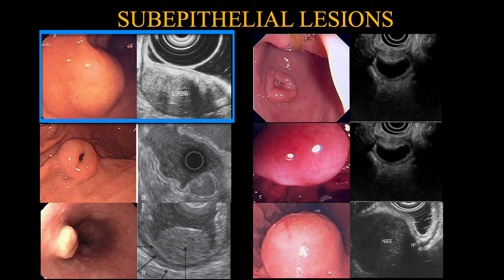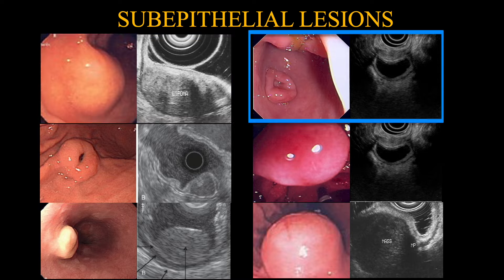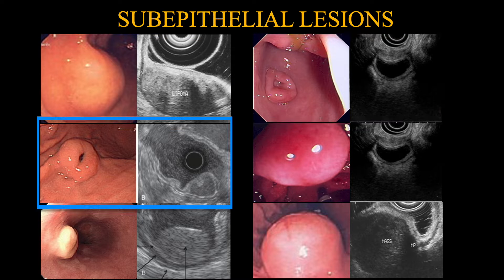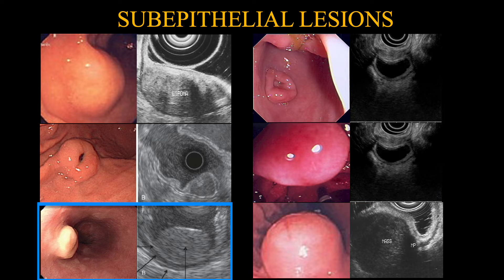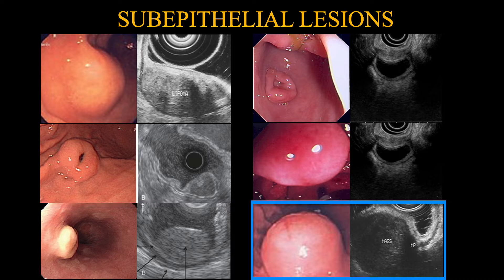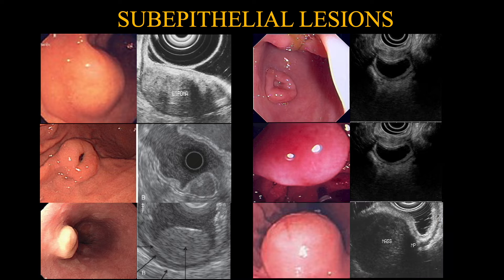Starting from the top left, we have a lipoma, followed by pancreatic rest to the right, then carcinoid tumour, a gastric cyst, a granular cell tumour, followed by a GIST lesion. It would be impossible to differentiate them without the aid of endoscopic ultrasound.